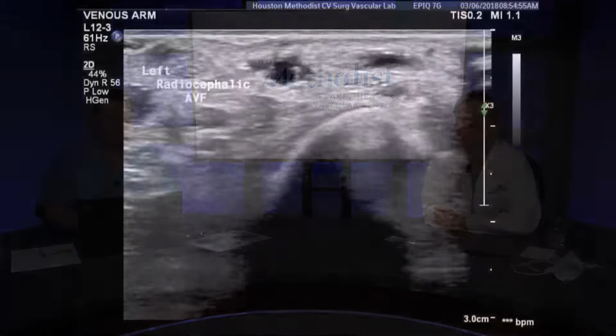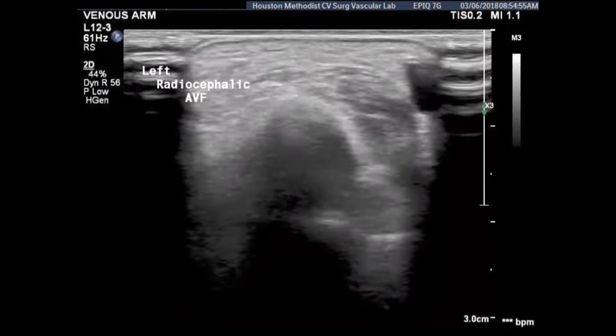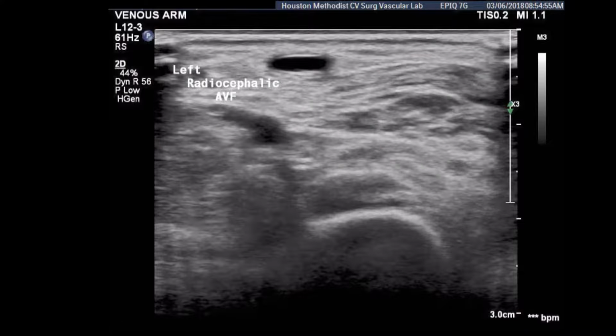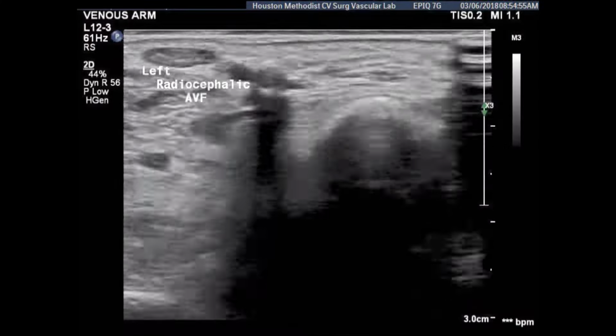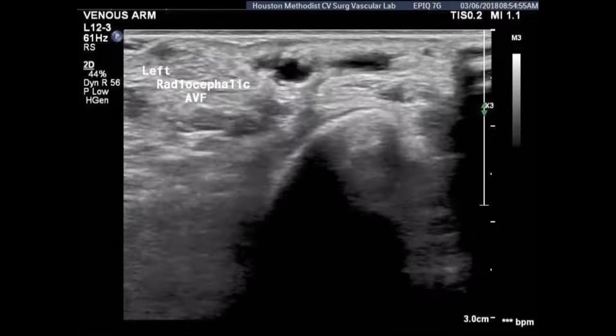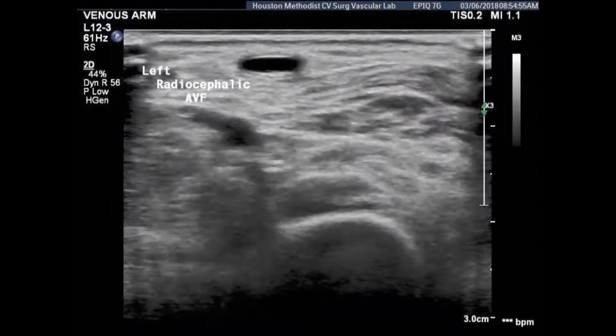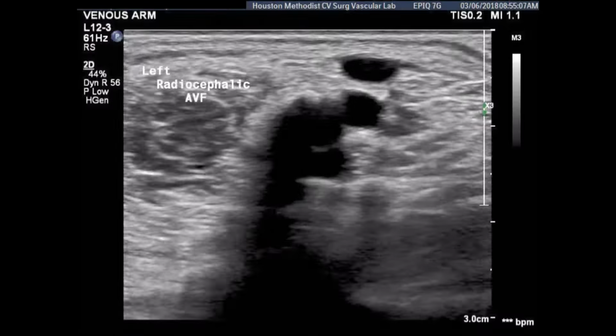And finally, I would like to ask you to please review this study with me. This is actually your first favorite scan. As you told us, you have your cross-section, and we are scanning first with the grayscale. Hopefully my second clip is going to be your colored. Hold on. Hopefully. I'm not going to give you too much hint, but yeah, that's great.